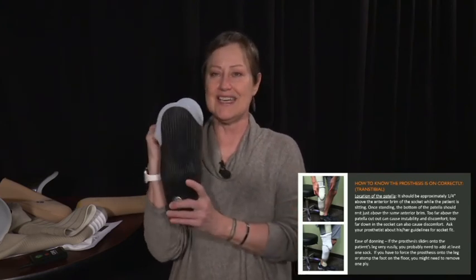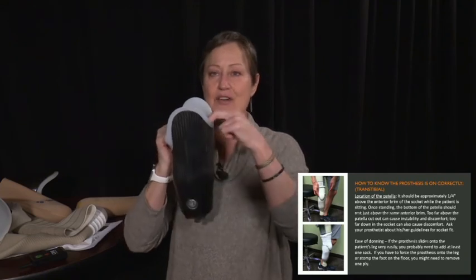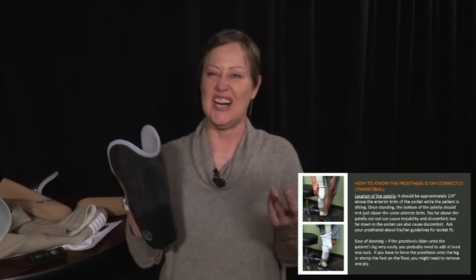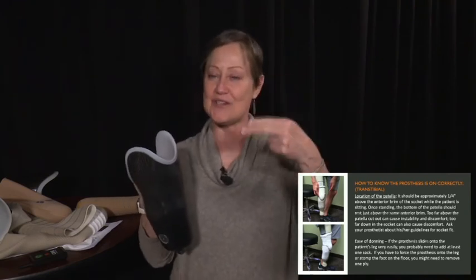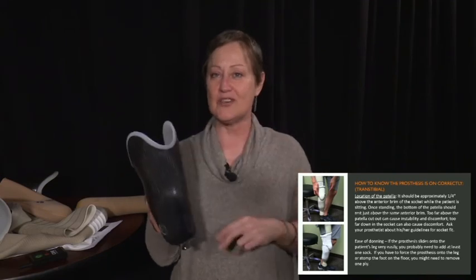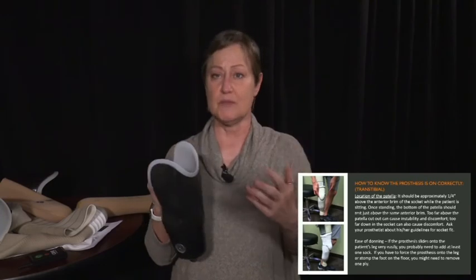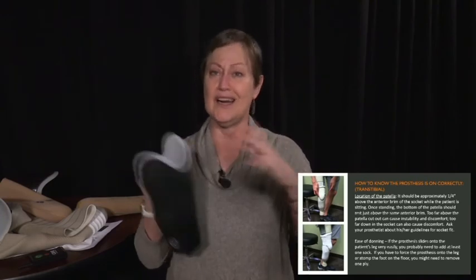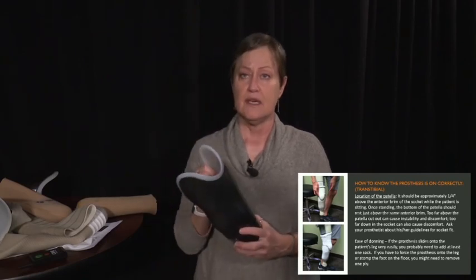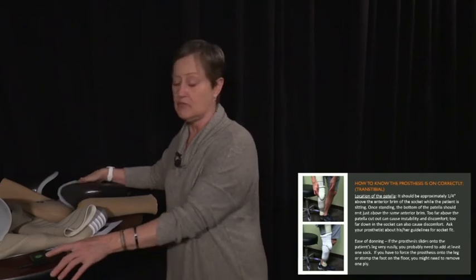Another thing, in sitting, if their knee is at 90 or a little bit less, and there's a big gap, I treat it almost like a dog collar, where you're supposed to be able to put 2 fingers under a dog collar and that's loose enough. If I can put 2 fingers in there, I know we're okay. If I can put my whole hand, or I'll joke with the patient, if I can put a whole sandwich in there, they need to add a sock. There is something going on with the fit. So that is some observation and some instruction as you go along.